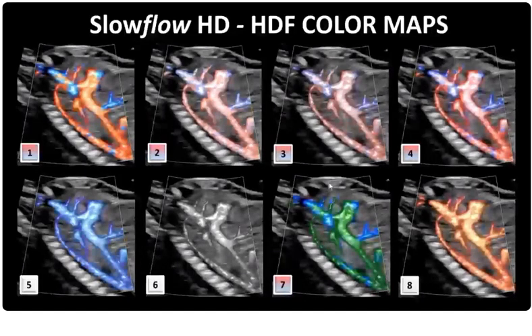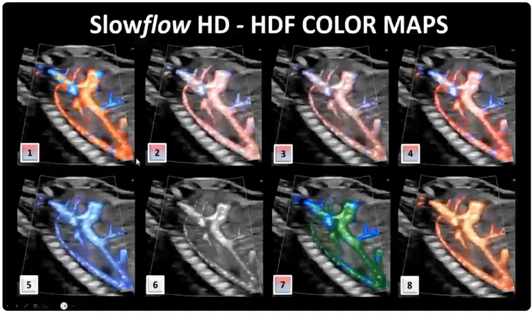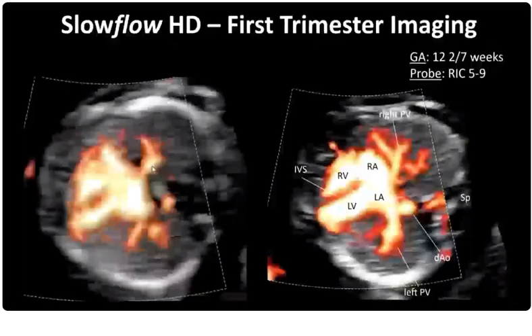The main advantage of this technique is to visualize flow, not really to detect direction. But knowing those limitations, you can choose between the directional and non-directional maps. Based on my experience, numbers 4 and 8 usually help to visualize things very nicely for me.